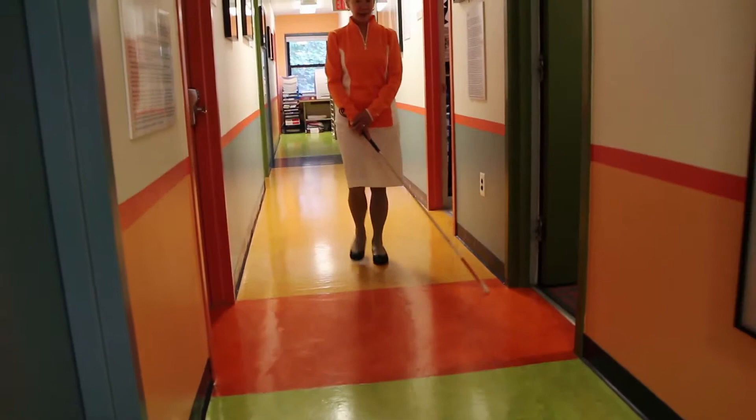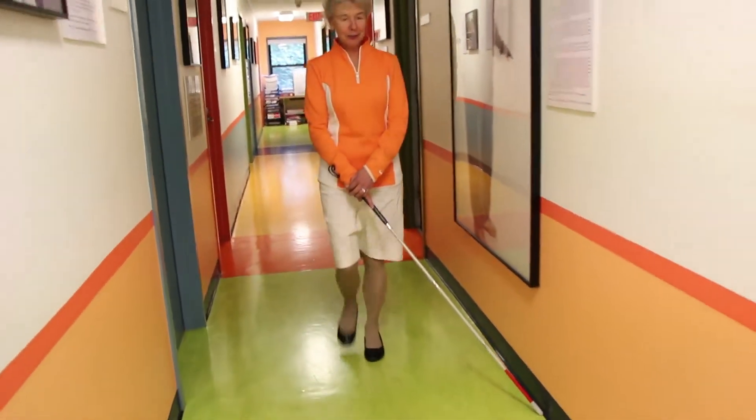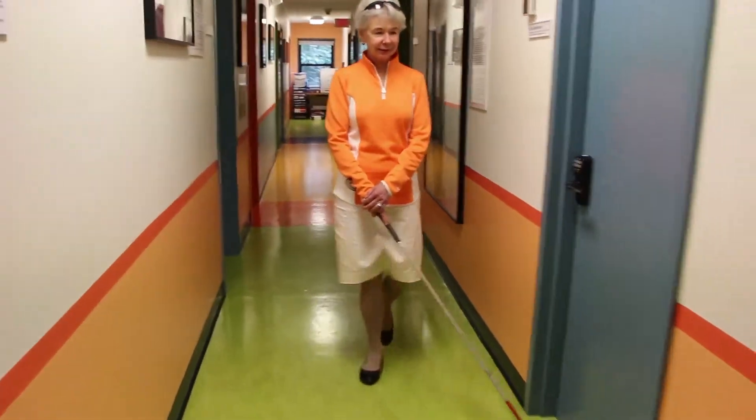There are many techniques a cane traveler can use to effectively and safely negotiate her environment. Here is a demonstration of the trailing technique.